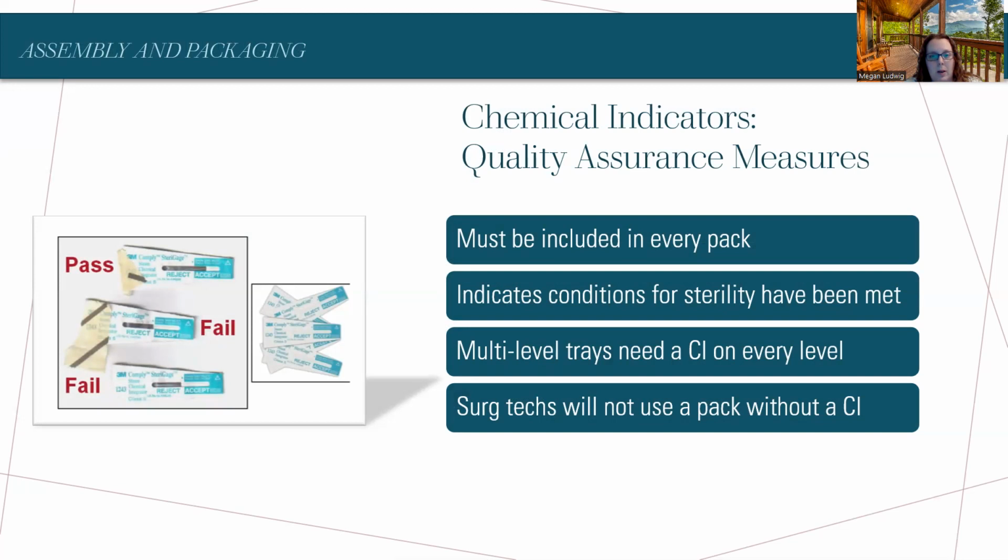Those are your biological indicators. Now, if nothing grows in those particular vials, then it's sterile. That's the only way to indicate that. Even still, we have to include our chemical indicators to show that it went through and the conditions were met in every single pack, every tray, every peel-packed item. It is so important. I can't stress that enough.